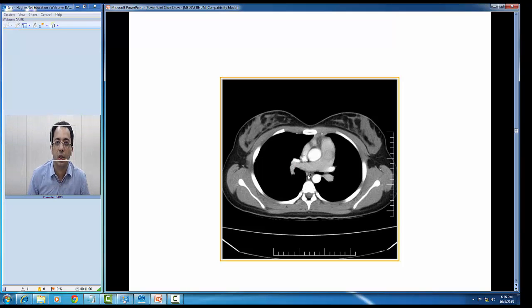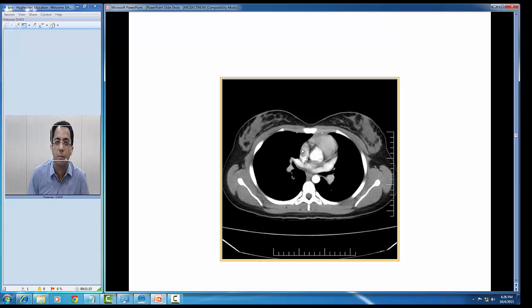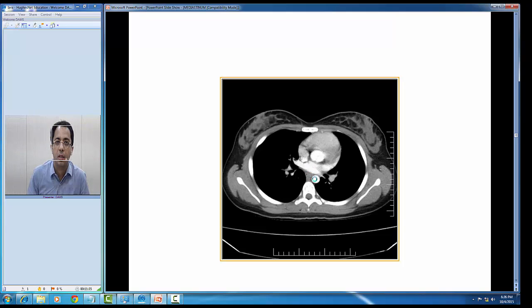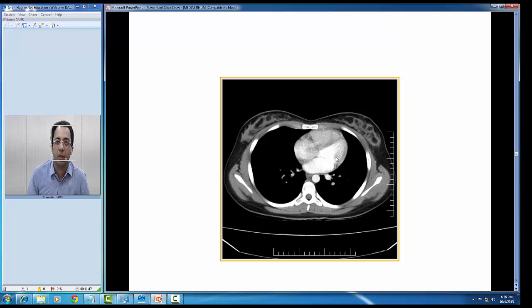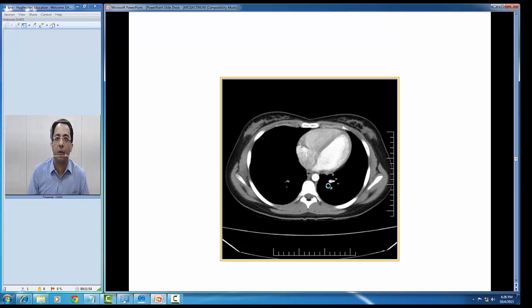Going down, you can see the esophagus, descending aorta, ascending aorta, and part of the right atrium. Going further down, this is the left atrium with pulmonary veins opening into it. Continuing down, you can see the left atrium, descending aorta, esophagus, right atrium, right ventricle, left ventricle, and left atrium.